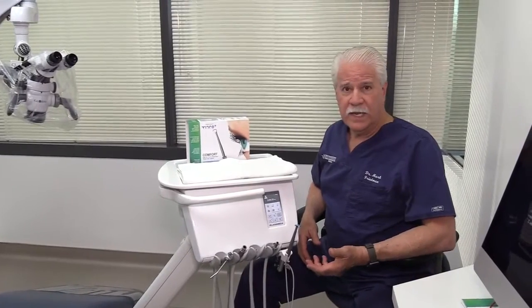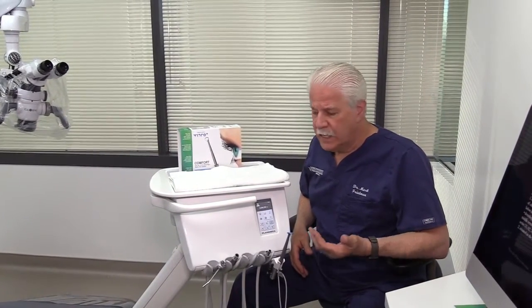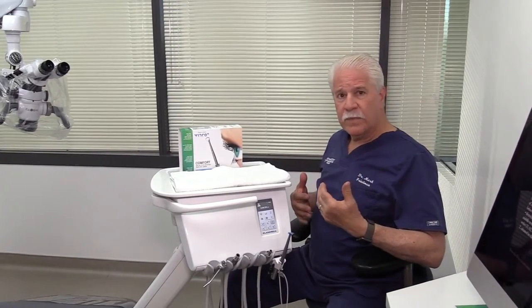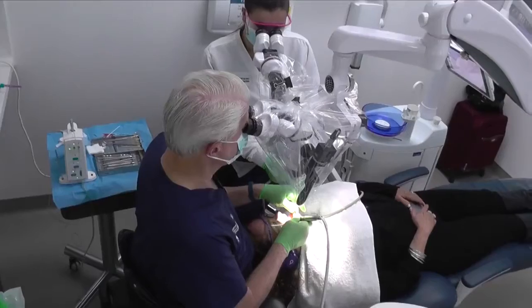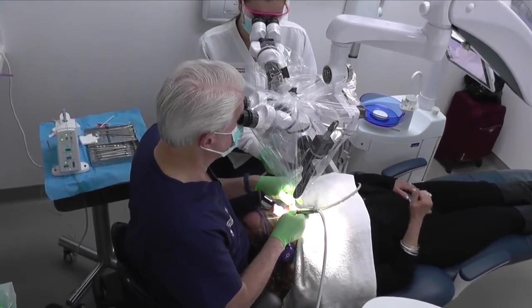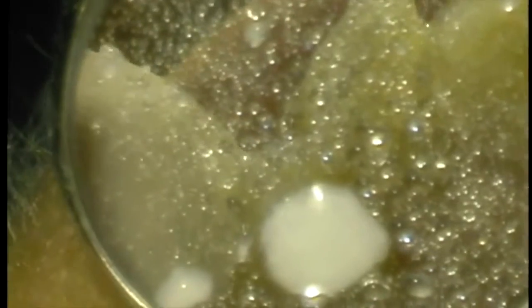In today's world of dentistry with high-level magnification, vision is the name of the game. To have good ergonomics, to sit at the 12 o'clock position and really work efficiently and ergonomically — head tilt between 12 and 20 degrees, everything in neutral — you really need to have good vision in your mirror, because without a clean mirror, we stop. Everything comes to a halt.